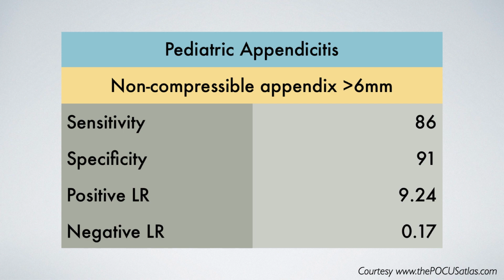Now, what do we know about appendicitis in kids and POCUS? Remember, ultrasound studies are operator dependent. However, a systematic review and meta-analysis showed that as ED providers, we're actually not too bad at diagnosing appendicitis, provided that we can find the appendix.